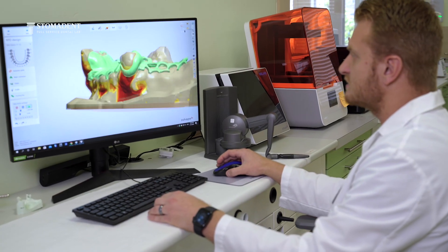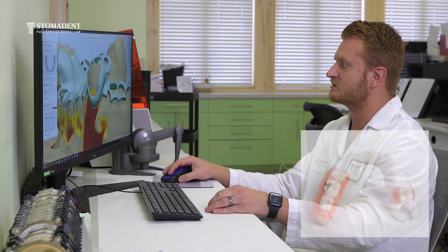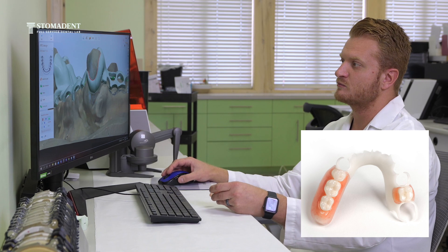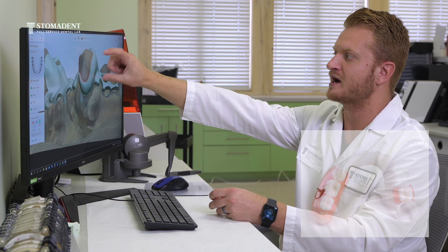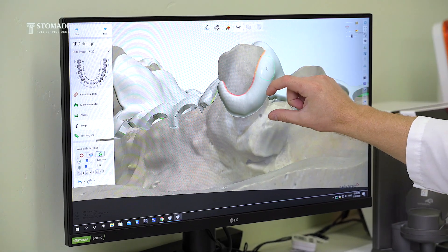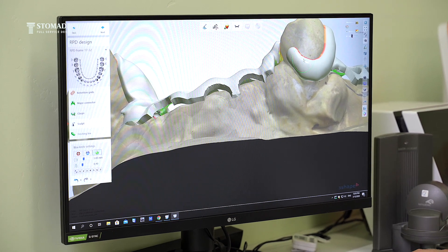You can see here with the design for the acetal framework, the clasp is much thicker where it's connecting to the minor connector, but also becomes thinner and more narrow as it goes to the mesial part of the tooth.